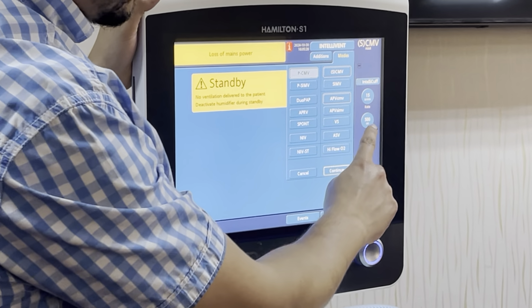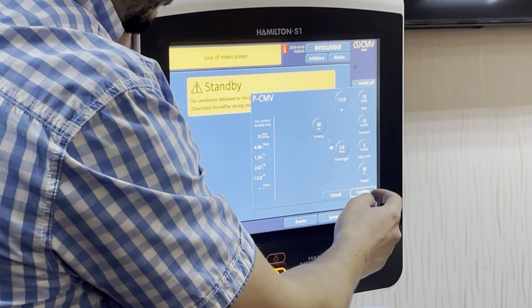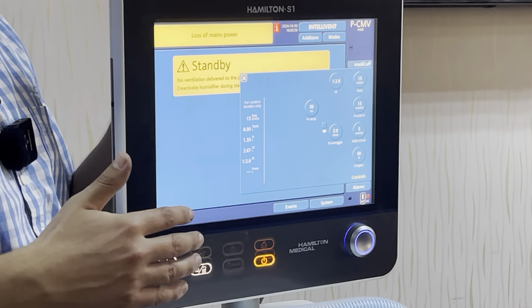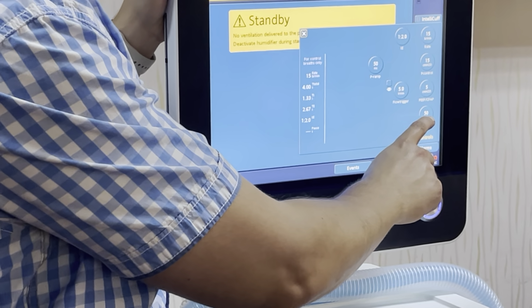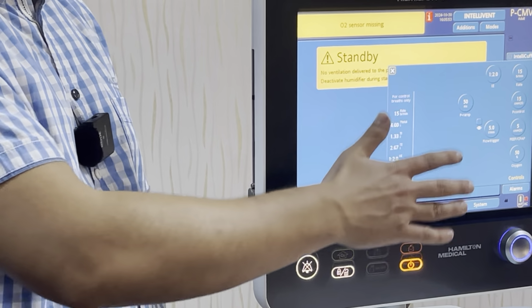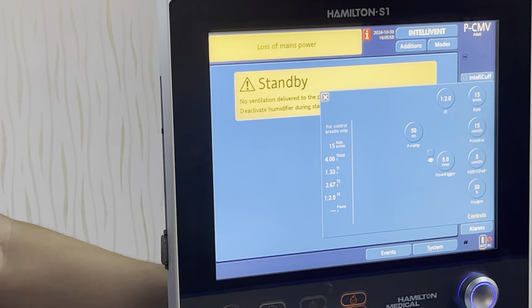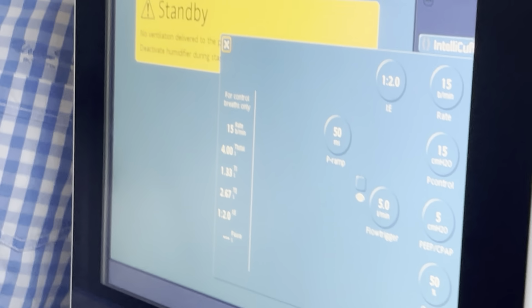The same for the PCMV. The only difference is that instead of a tidal volume, we will have a pressure control. It's important to know that the pressure control is the pressure above the PEEP level. So if I set the pressure control at 15 and the PEEP at 5, the peak will be 20. So normally the patient will be ventilated with these fixed parameters. Let's say, for example, after some time the patient has recovered and starts having some spontaneous breathing by himself. So what will happen in this case?